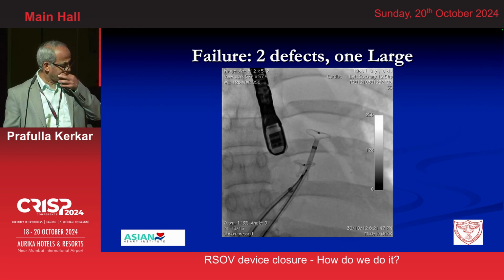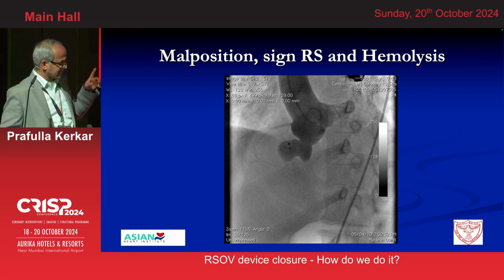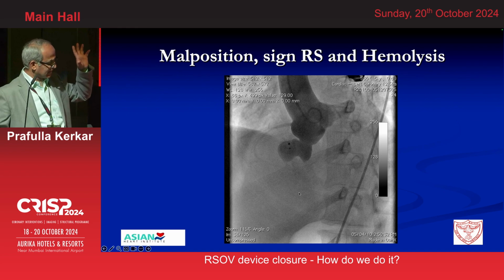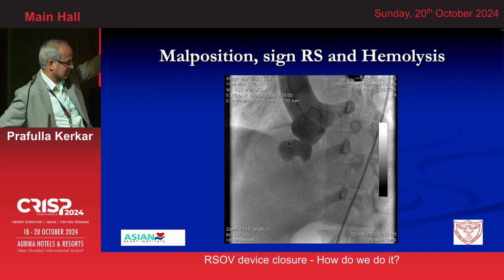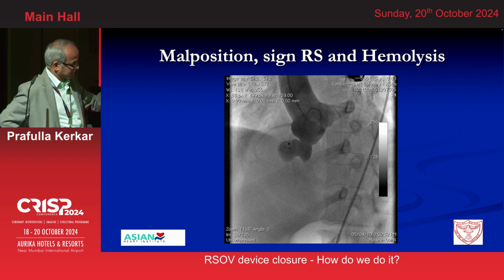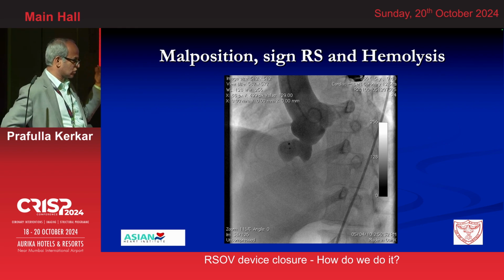Prafulla, I wanted to ask you about that previous patient: why did you not make use of that other exit and close it at that level? There is just one exit here. What has happened is that the device was meant to be at the aortic end, the 16 by 14, the largest available. You brought it there and it slips. Okay, it slips, but it's closed here. There was a residual shunt, so we accepted it.